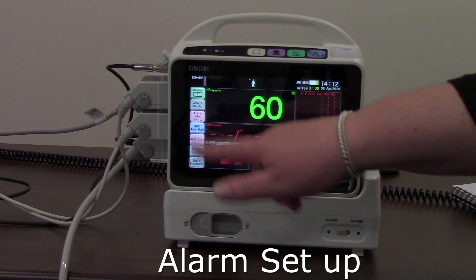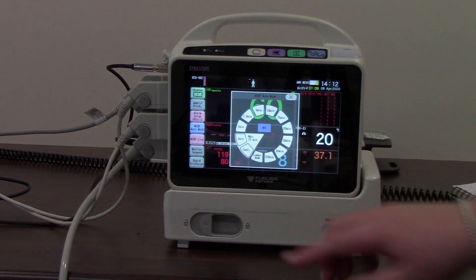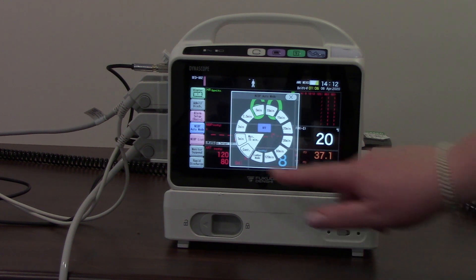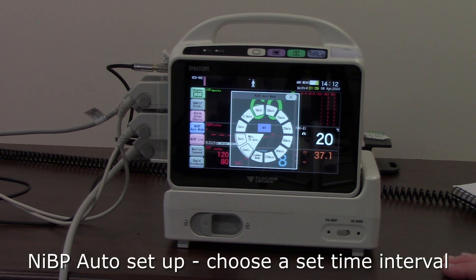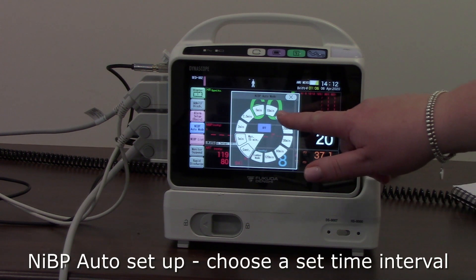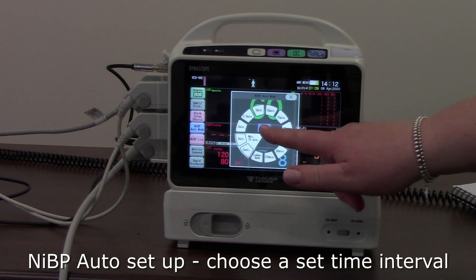Just below that we have our non-invasive blood pressure auto mode setting. If you touch that, it brings up a scroll wheel to change how often you want the blood pressure cuff to inflate. For example, if I wanted it every 15 minutes, I select that, press the blue go button, and it will inflate every 15 minutes until I turn it off.